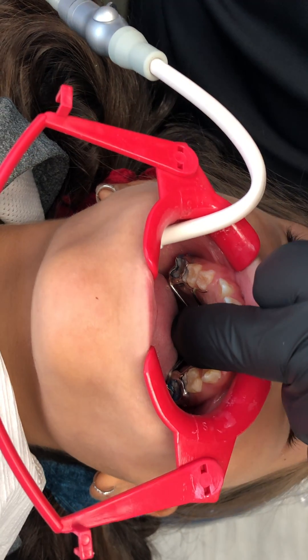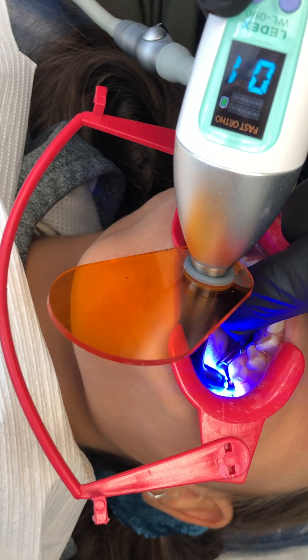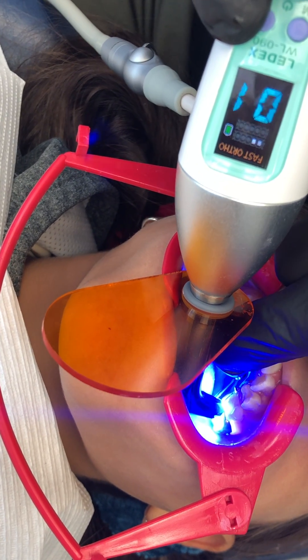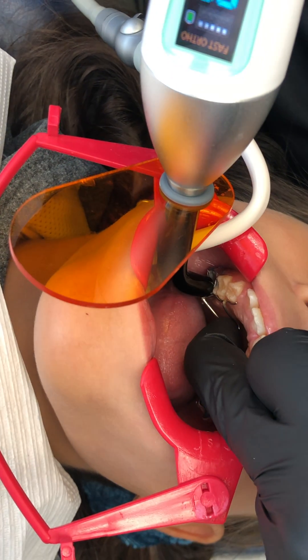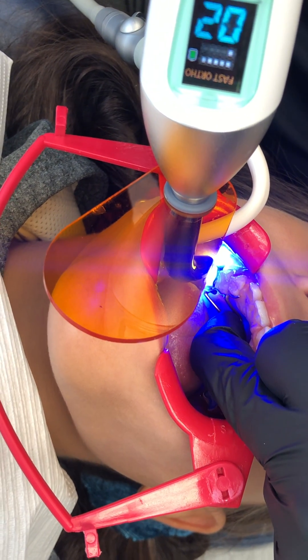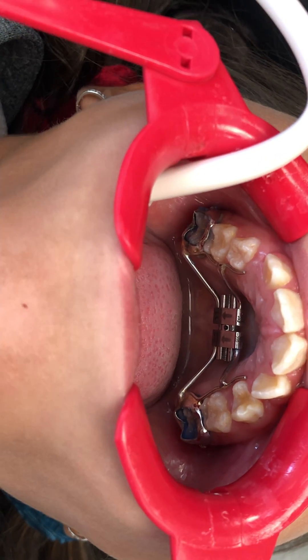I'm holding pressure on the screw area and then we're simply going to cure it. This is a three-second light — I'll give three rounds and go over each cusp individually. Coming around to the other side, the whole time I'm making sure we have pressure because it doesn't fully grab the teeth mechanically and we don't want it to move during the curing process. And there we are — our laser sintered expander, all done.